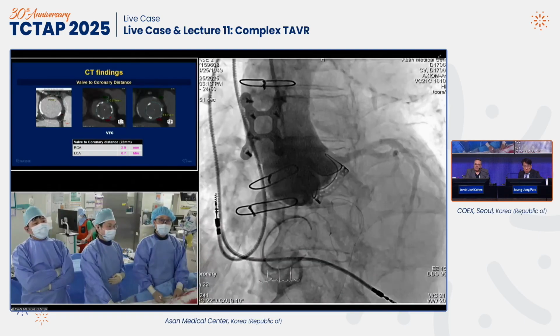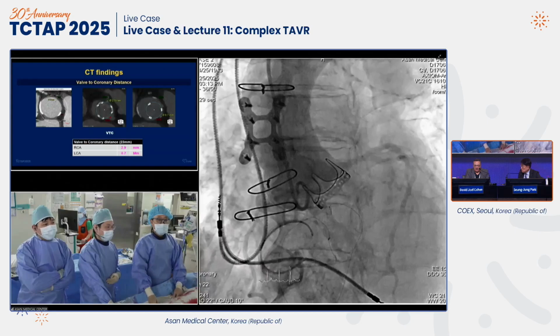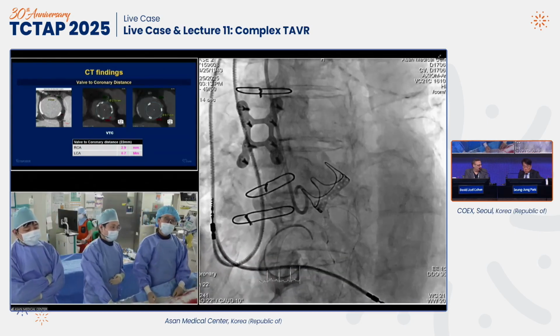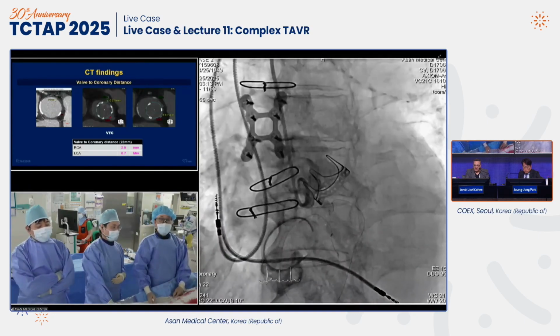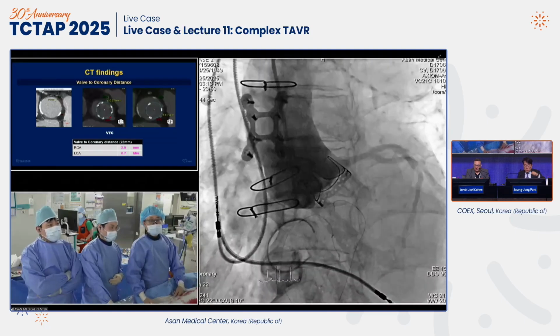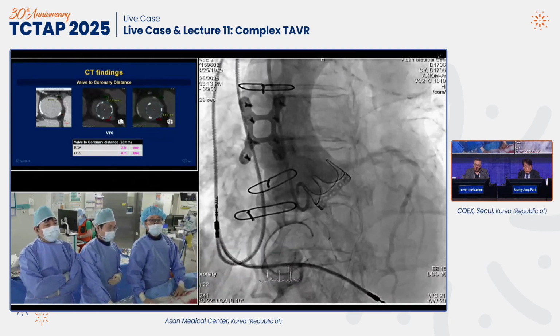But we like to use BASILICA. We're very comfortable with it. We've done a lot. We have Jafar Khan, who's in our center, who's an expert in it and makes everything look easy. So I think that would be my recommendation. It certainly is not as expensive for us to do that. And we are looking forward in the United States.